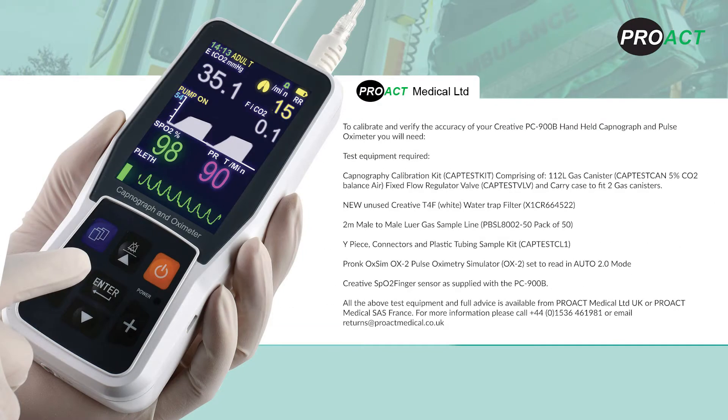To calibrate and verify the accuracy of your Creative PC-900B handheld capnograph and pulse oximeter, you will need a capnography calibration kit comprising a 1/2-litre gas canister, 5% CO2 balanced air, fixed-flow regulator valve, and carry case to fit two gas canisters.